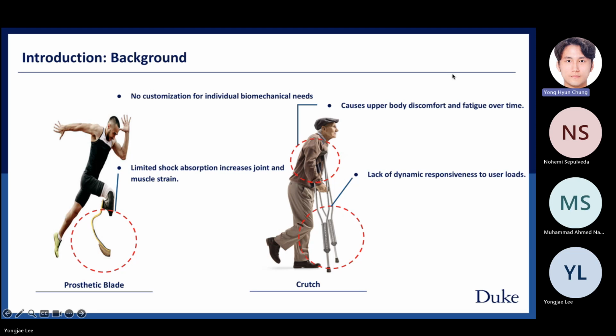Currently, traditional crutch designs lack dynamic responsiveness and adequate shock absorption, often leading to user discomfort and upper body strain. Our crutch project aims to address these limitations by integrating a mass spring damper system, offering adaptive damping and propulsion to enhance mobility and user comfort across diverse needs.